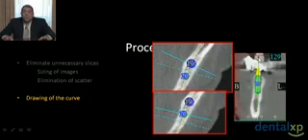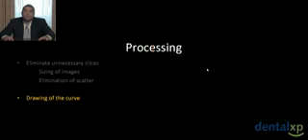When we rotate the implant within that cross-sectional image, it will rotate in that path and plane. So what does that mean? That means when we rotate them the same number of degrees, let's call it buccally, they're actually going to converge on each other while we think we're rotating them parallel to each other.